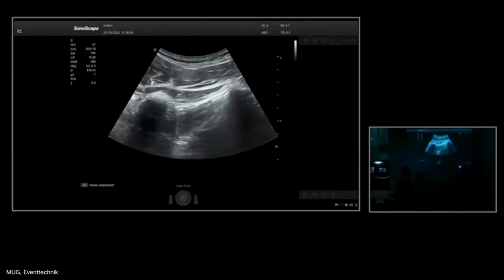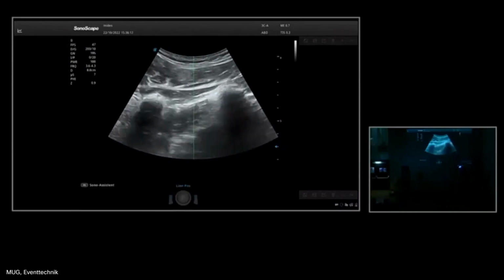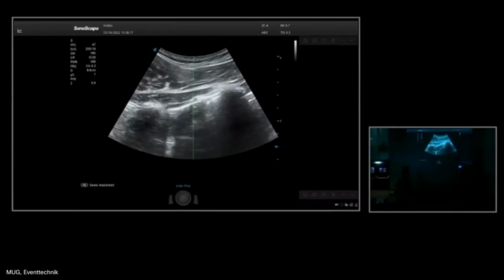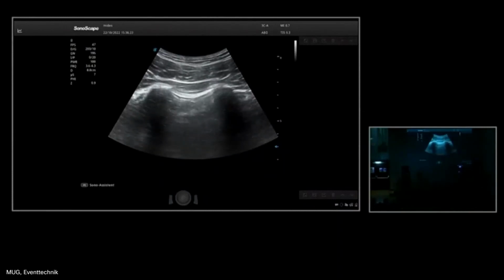Okay, it's okay. So M mode at the end. Also, we are going to do it on the other side.